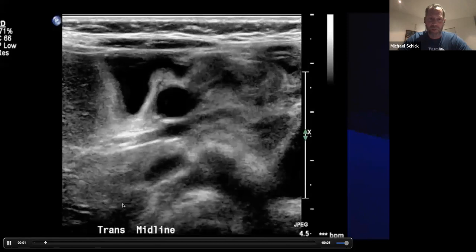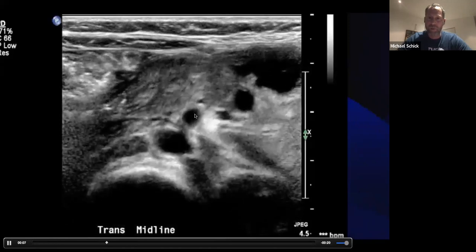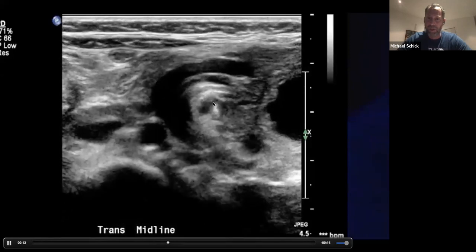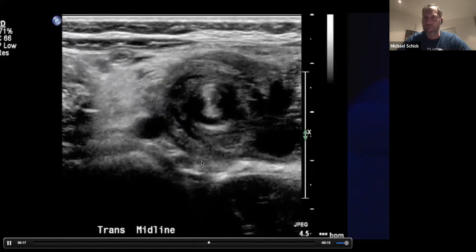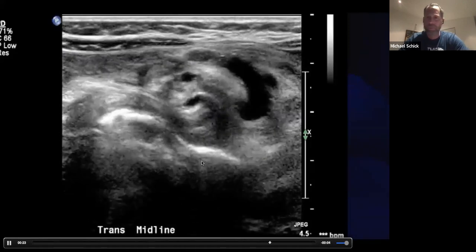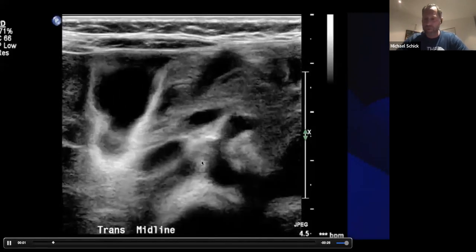But you have the shadow of the spine. You have the aorta. It's giving off the superior mesenteric artery right here. And if you follow that artery into the mesentery here, you can see it just spin around and give us that classic whirlpool sign. All right, so that's midgut volvulus.